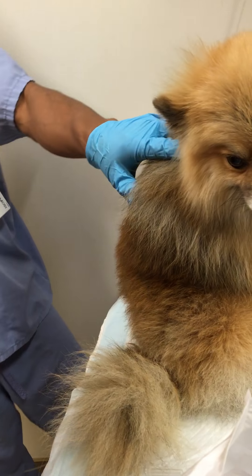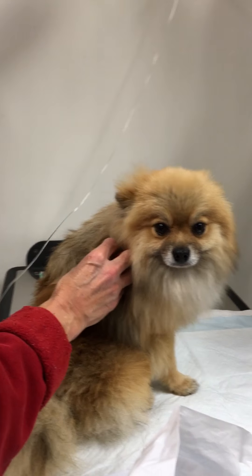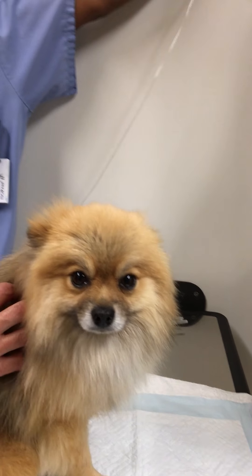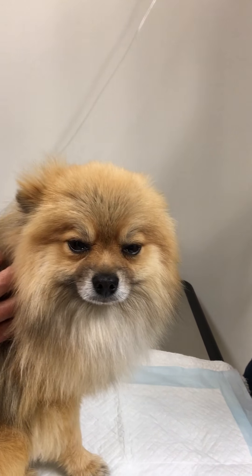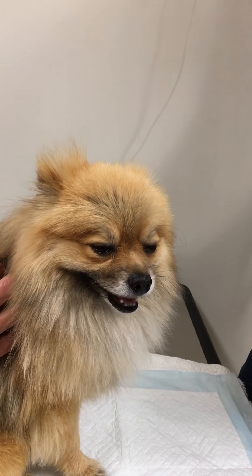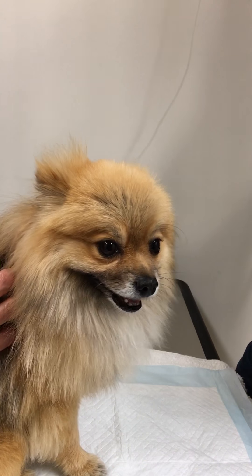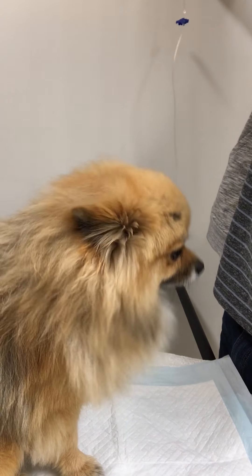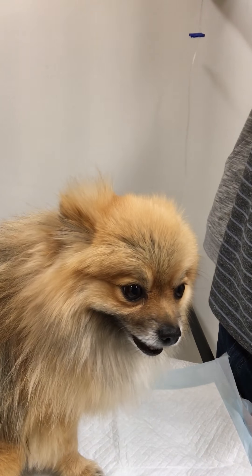So you see there's already fluid. I'm going to show you, okay? I don't want it to jump. Who put this in here? Dr. Schmidt. So whenever you see fluid here, this should be fluid here as well. It's still clamped. The clamps are dead. So how do you do the clamps? You better teach me that too. Push. Push. And now it's unclamped. Now this one's closed.